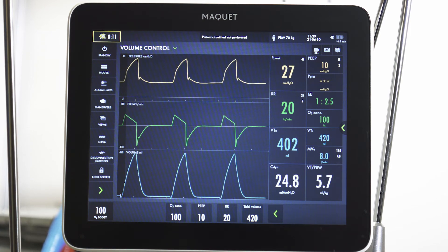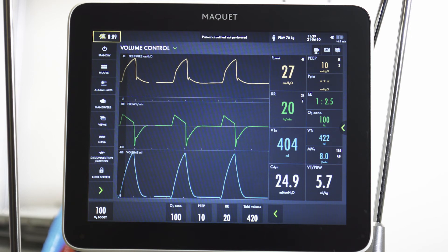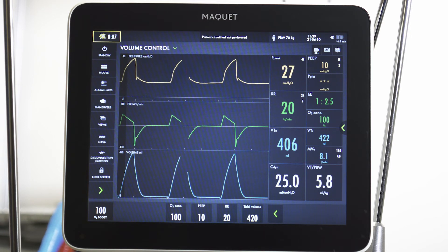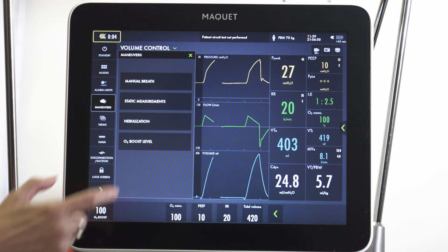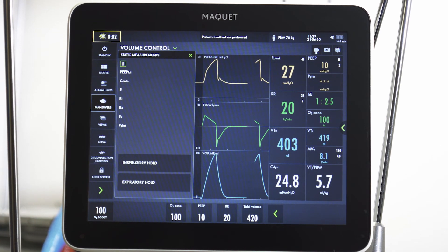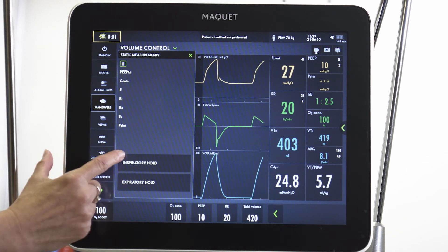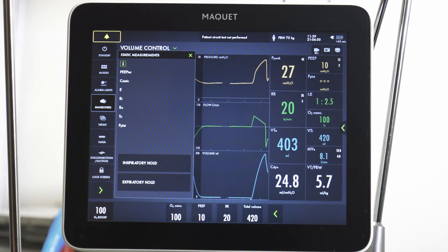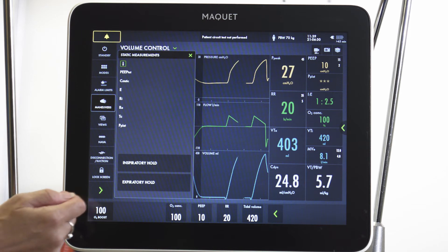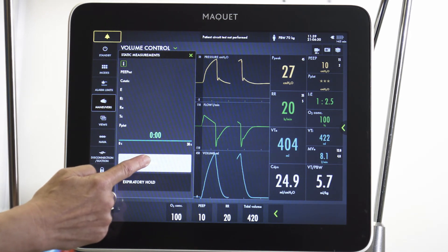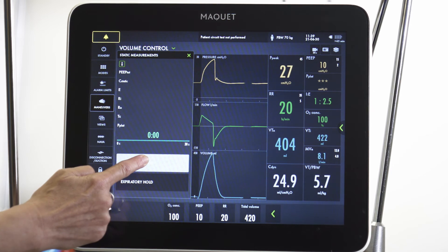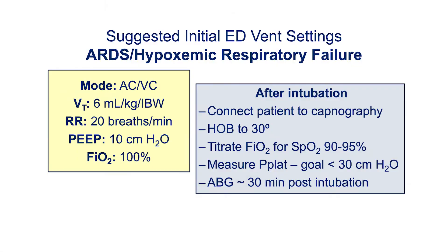Once we've initiated ventilation, we also want to find a plateau pressure, which will reflect the pressure the alveoli and small airways are exposed to during mechanical ventilation, or the pressure to hold a given volume. Once we press and hold the inspiratory hold button, that plateau pressure will register, and we are shooting for a pressure less than 30 centimeters of water.